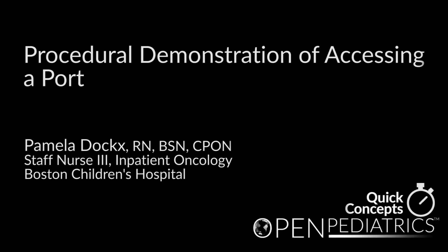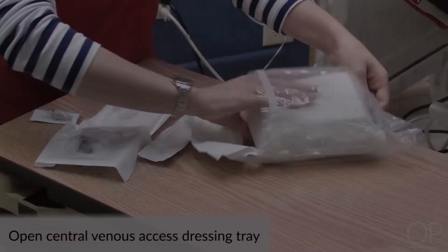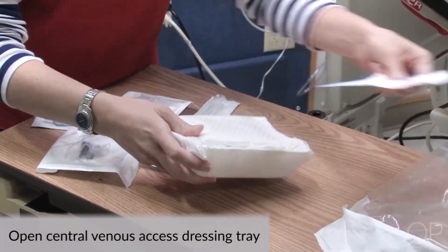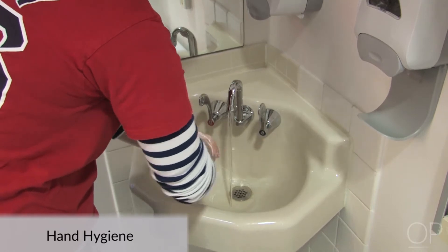Procedural Demonstration of Accessing a Port, by Pamela Docks. Open the central venous access dressing tray and don a mask. Perform hand hygiene, including a 30-second hand wash.